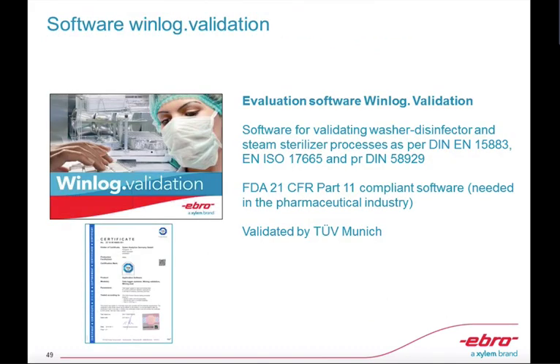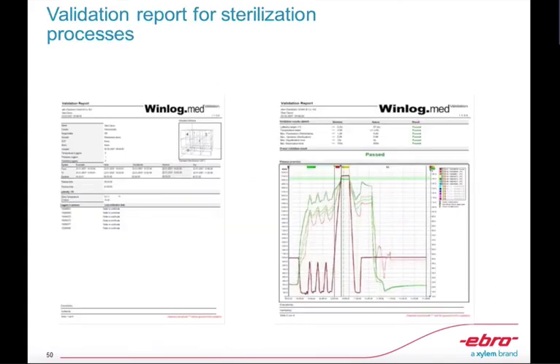Then I have mentioned there are some software packages that are very important for all those that we have talked about, the WinLog validation and the WinLog Med.